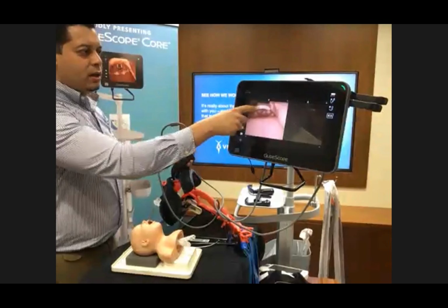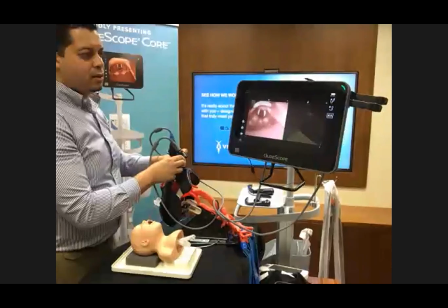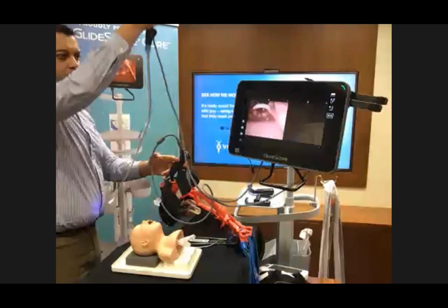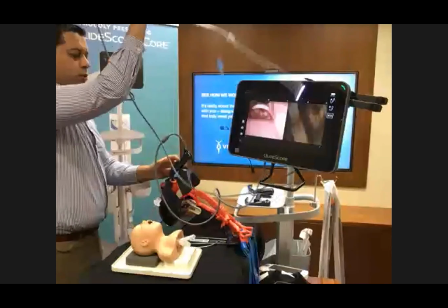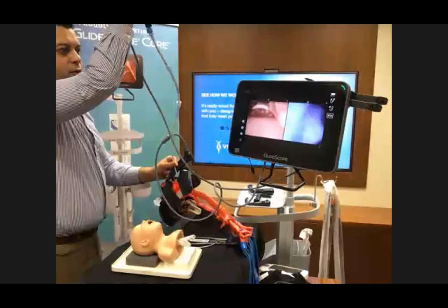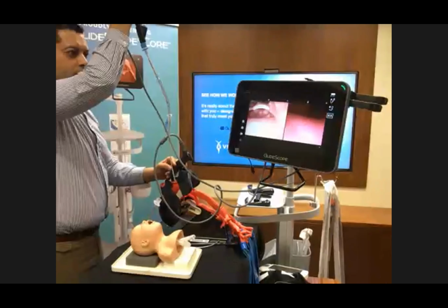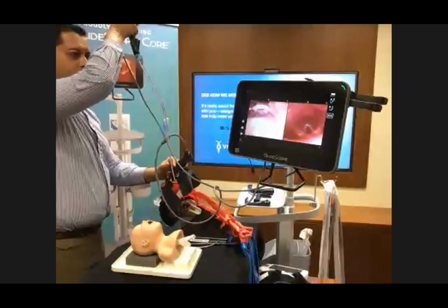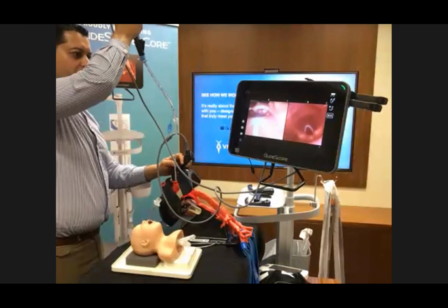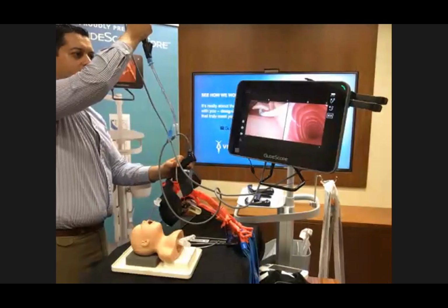So once you place the blade inside, you can see here the vallecula where I put already the blade and it's having the larynx in the best shape. And once you place it inside, you might be able to use also the bronchoscope along it. So as you can see here, you might be able to lift and see also the larynx, and you can see the tip of the bronchoscope here. So you can easily drop it further. And once you drop it further, you might be able to have the perfect condition here where you find the tracheal ring.